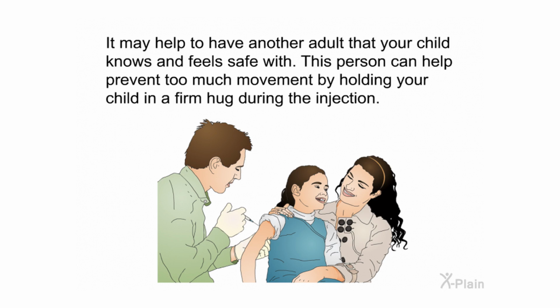It may help to have another adult that your child knows and feels safe with. This person can help prevent too much movement by holding your child in a firm hug during the injection.